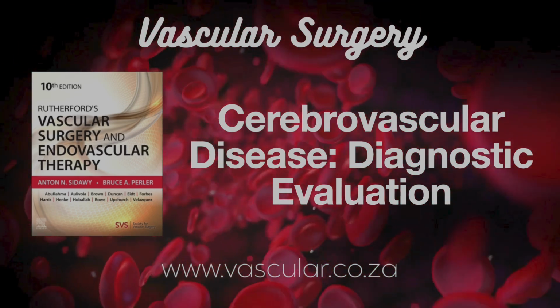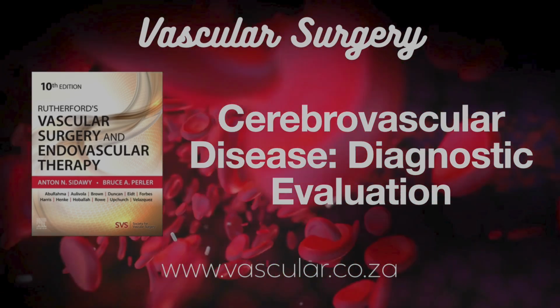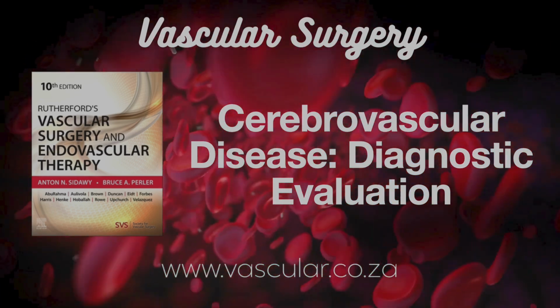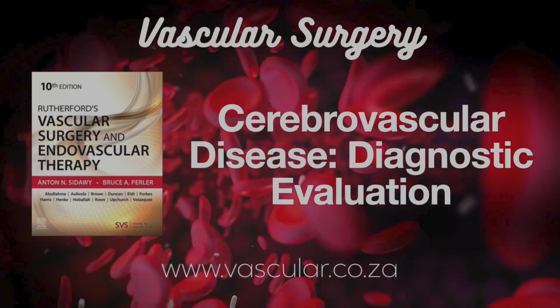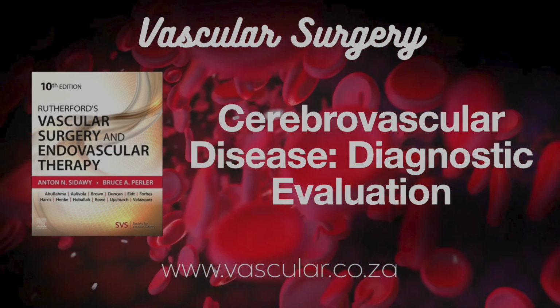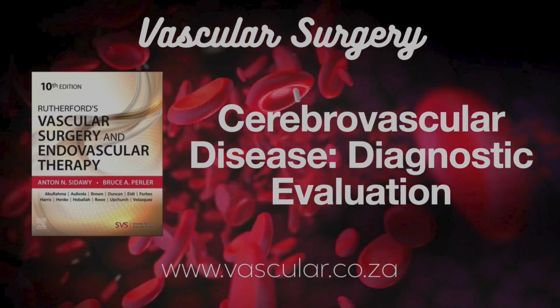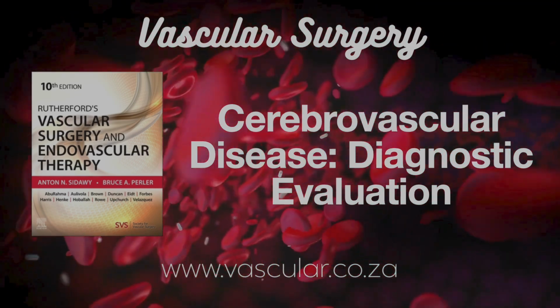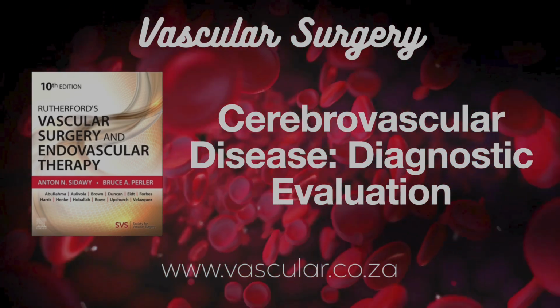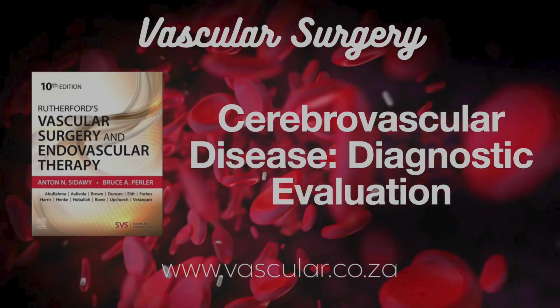What are the advantages that keep DSA relevant, even if it's used less often? Well, that image quality is superb. It's accurate, objective, usually easy to interpret. It can see everything from the aortic arch right up into the tiny vessels inside the brain. The whole system. The whole relevant system. It's particularly helpful when, say, the DUS and the CTA or MRA findings don't quite agree. They're discordant. To break the tie.